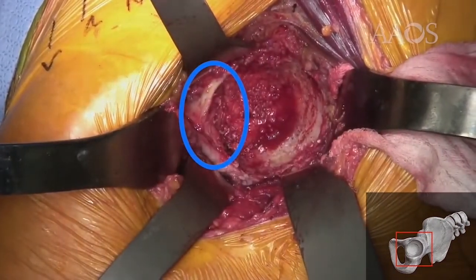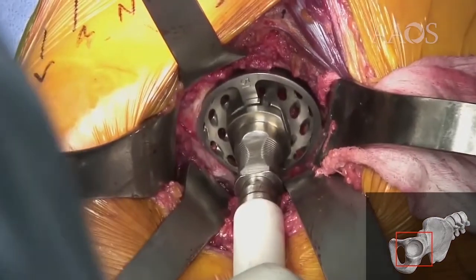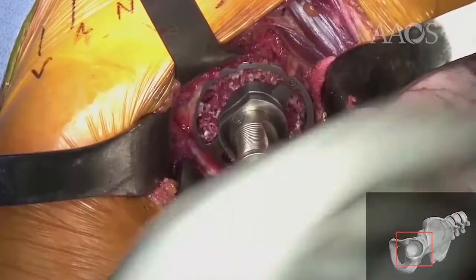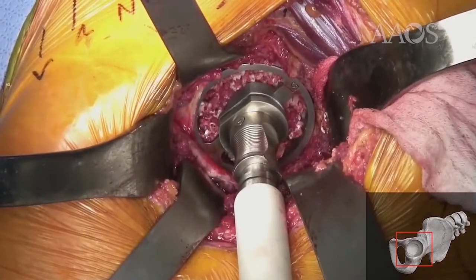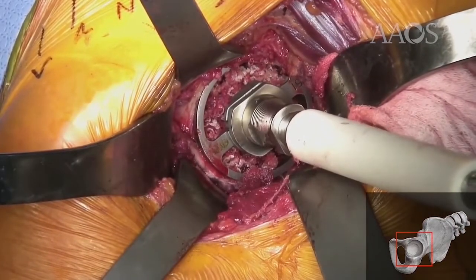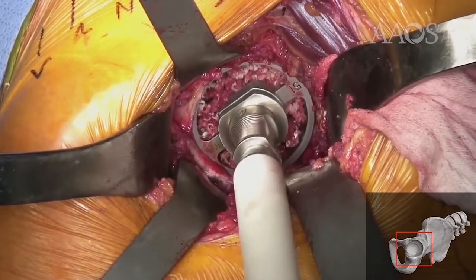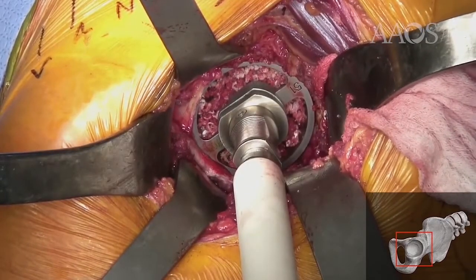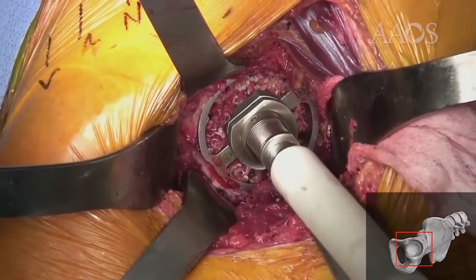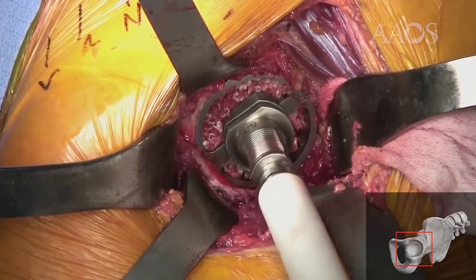At every stage, we insert the reamer and move the medial side of the reamer inside the TAL to preserve it. You can see here, this is demonstrating initially too lateral, and then we move the reamer into a more neutral anatomic position medial to the TAL, which is the correct position.